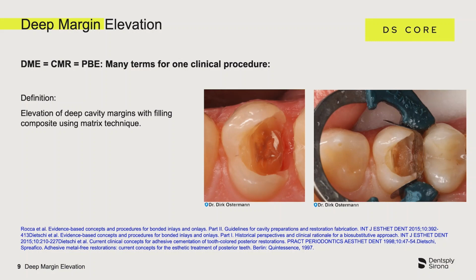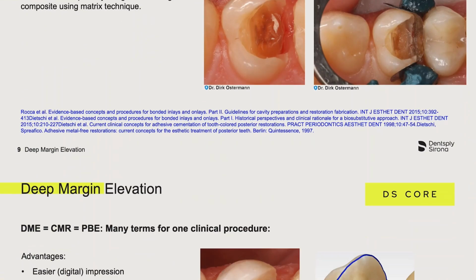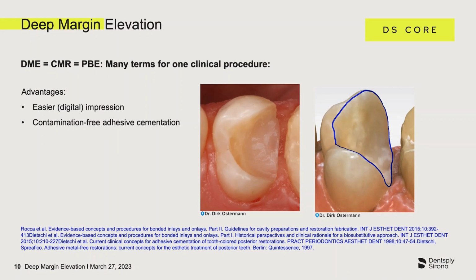Whichever term is used, all these terms have the same definition, namely the relocation of a deep subgingival cavity margin with the help of a composite filling using the matrix technique. Any practitioner can easily see the advantages of this approach.